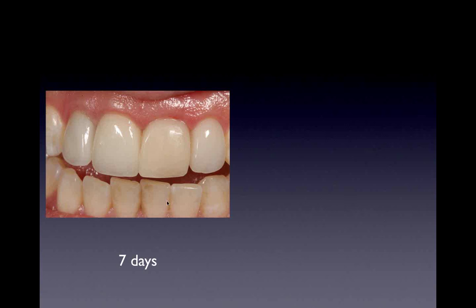This is her Facebook picture before. This is her Facebook picture 2 hours after. So you can see she's really happy about having that provisional. But it has to be those three components. Please don't forget those three criteria. Buccal plate has to be in place. Has to be out of occlusion in centric position, which means it may be a little shorter, and you need an internal connection to get it to stay. So you can see it's a little bit shorter than her other tooth.